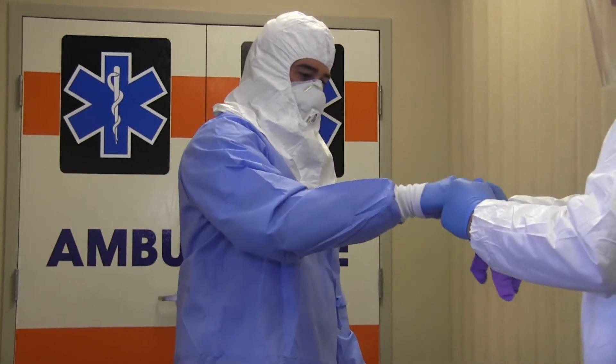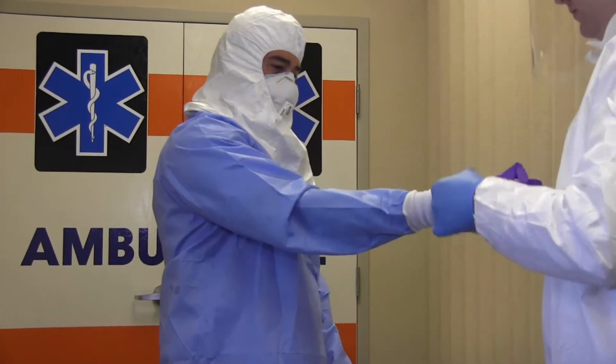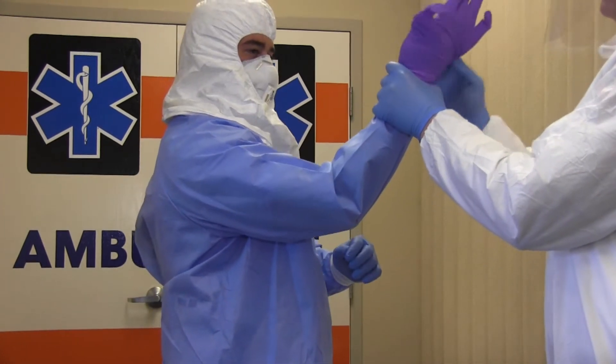Now you will put on the extended cuff gloves, or what we will refer to as your outer gloves. Ensure the cuffs are pulled over the sleeves of the gown.